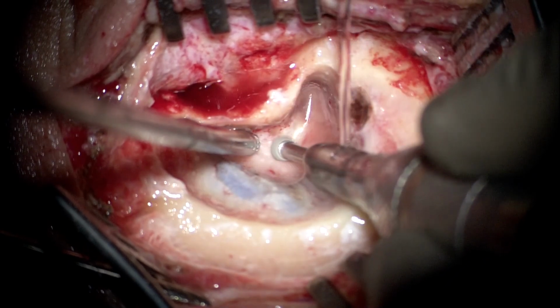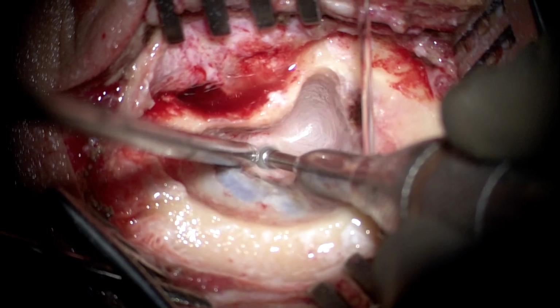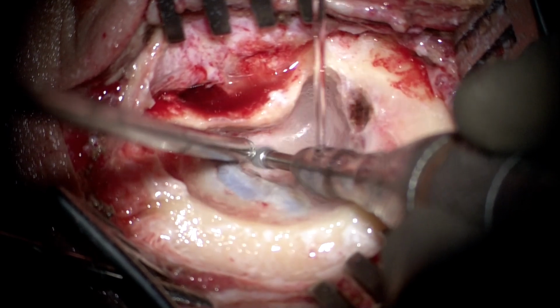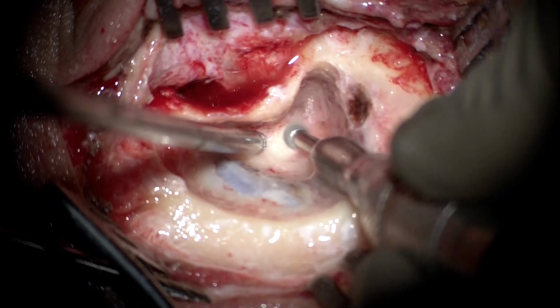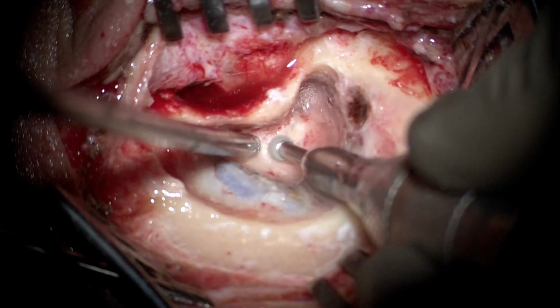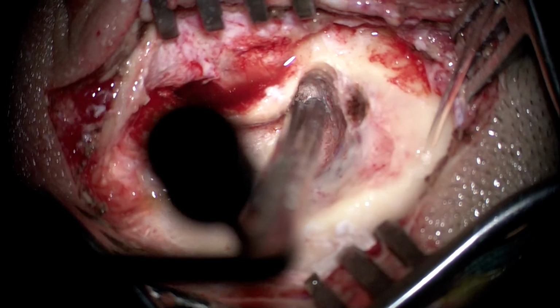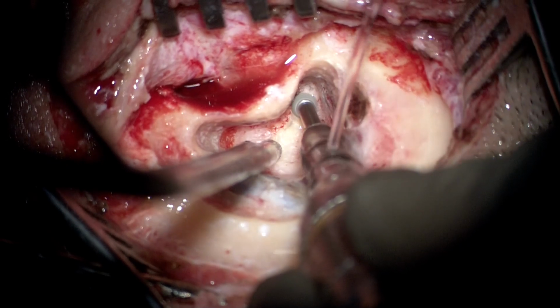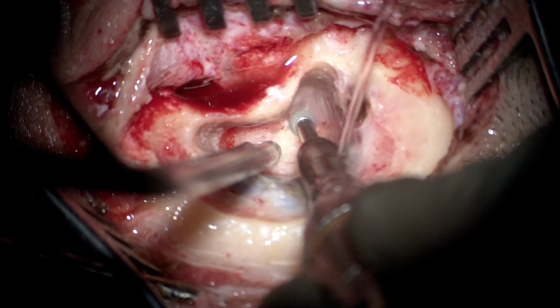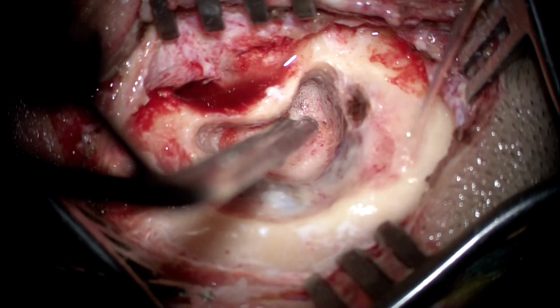Now, though we have to drill in the direction of the respective canals, this is not a beautification sort of surgery, like we do in temporal bone drilling, to first define all canals and then drill. This has to be done with certain time constraints in mind. Hence, all three labyrinthine blocks of bone would be drilled one by one together, and the exact canals or their domes would not be defined, in contrast to a temporal bone drilling exercise.